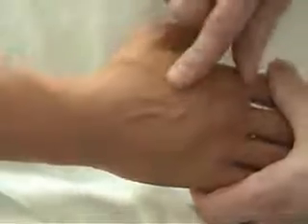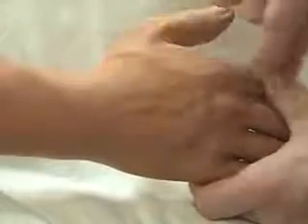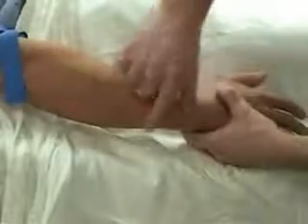The first place to check for a vein is in the hand. Looks can be deceiving, so go by what you feel, not by what you see. Find a vein that feels plump, one that is firm yet gives. The vein should also be relatively stable, without moving too much under the skin.